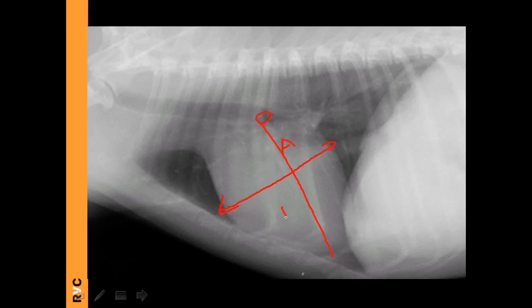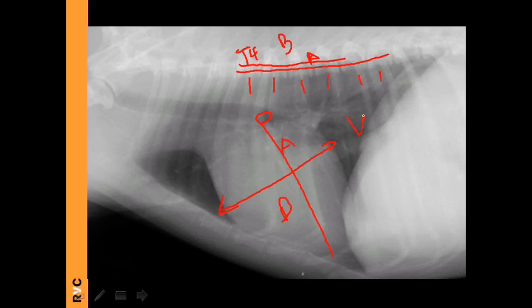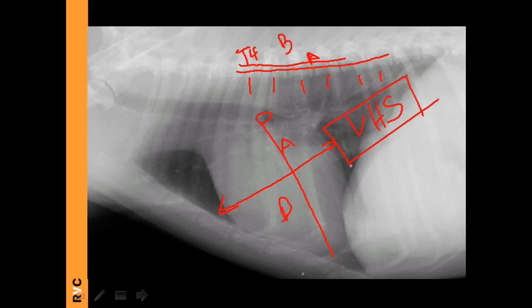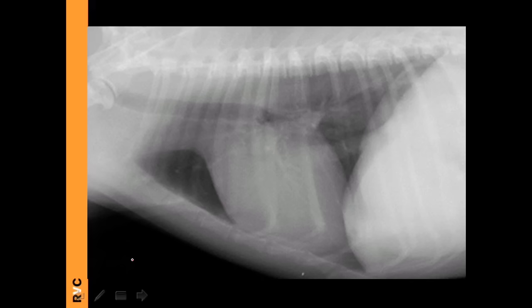Another familiar measurement is the vertebral heart score (VHS): measure the height (A) and the width (B) of the heart, start from T4, apply A and B, and count how many vertebrae are included. The VHS is very useful if you have a breed-specific reference, because the original 8.5–10.5 range cannot apply to all breeds. It is also very useful for comparing the cardiac silhouette across two separate occasions in the same animal to determine if it has become bigger or smaller.